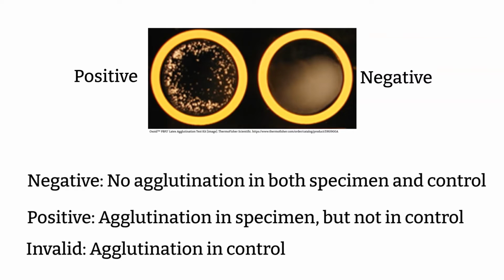There are some limitations to this type of testing. True positive results generally have strong reactions, and false positive reactions have been known to occur rarely, but are generally limited to weak reactions. Such results can be verified by retesting with a fresh culture. False negative results can occur if insufficient culture is used for the test. In such a case, the test should be repeated with sufficient culture. Some organism strains may have a lower level of methicillin resistance, or in rare cases, produce PBP2a in low amounts and can cause false negative results.